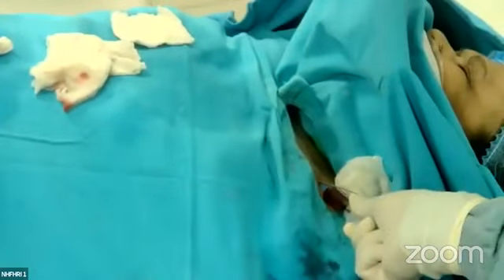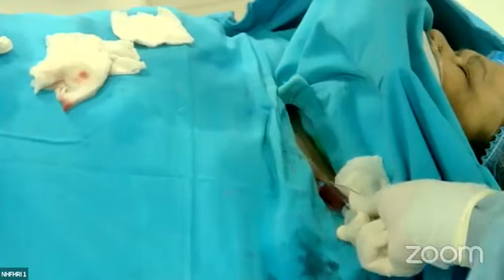So this is the venous. Is it seen here? Yes, now seen. Now this is the short wire. Now show me the wire. This is the second puncture. Focus on the monitor, please. So this is the puncture. This is the second puncture.